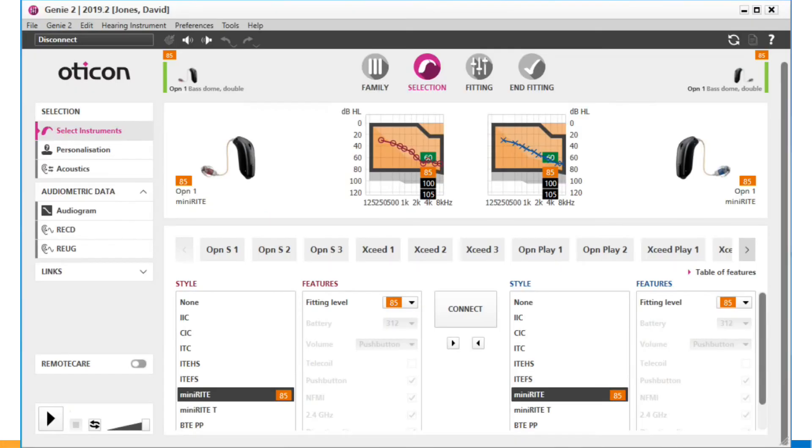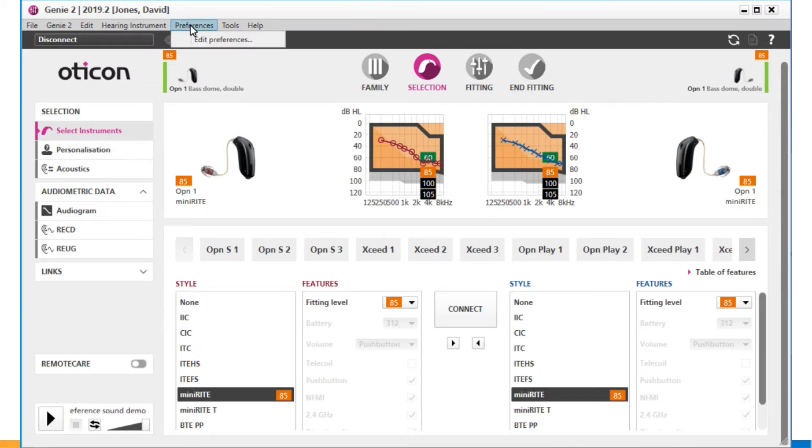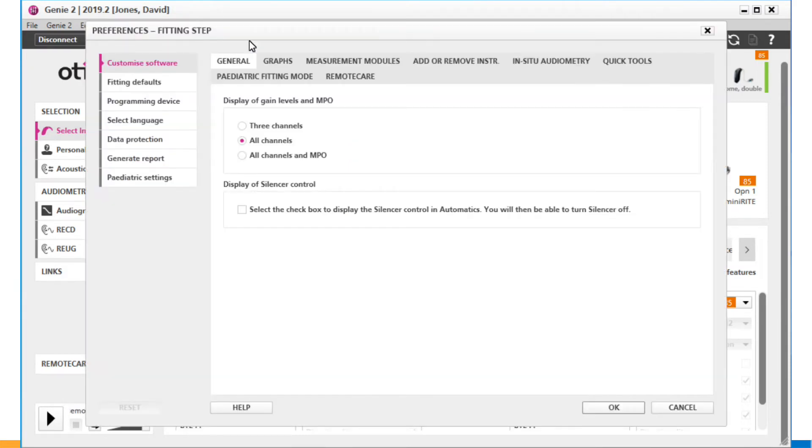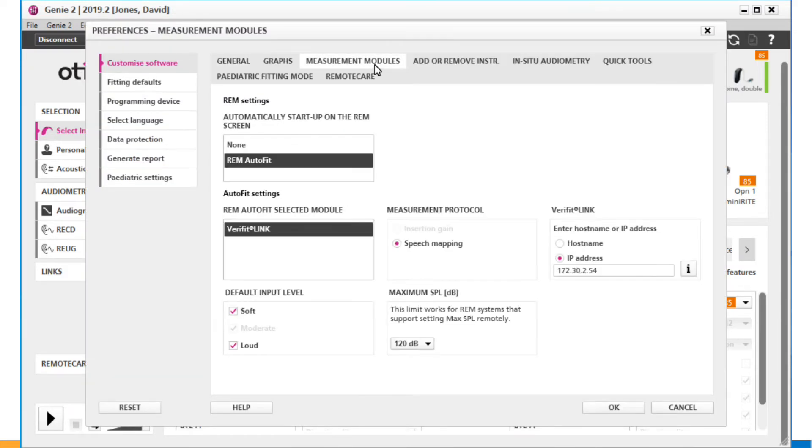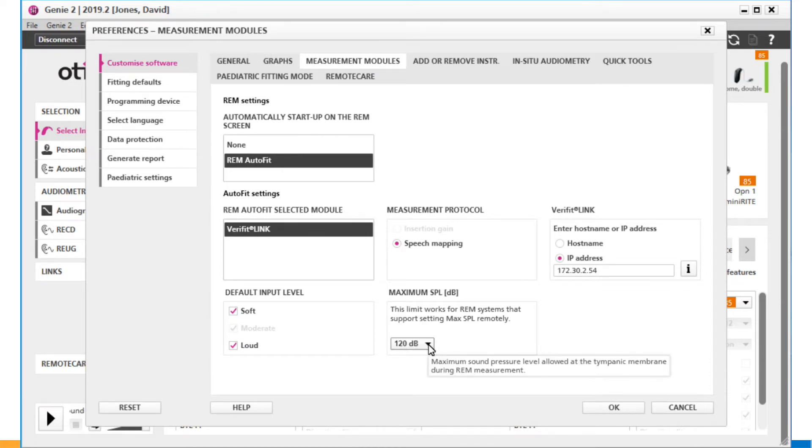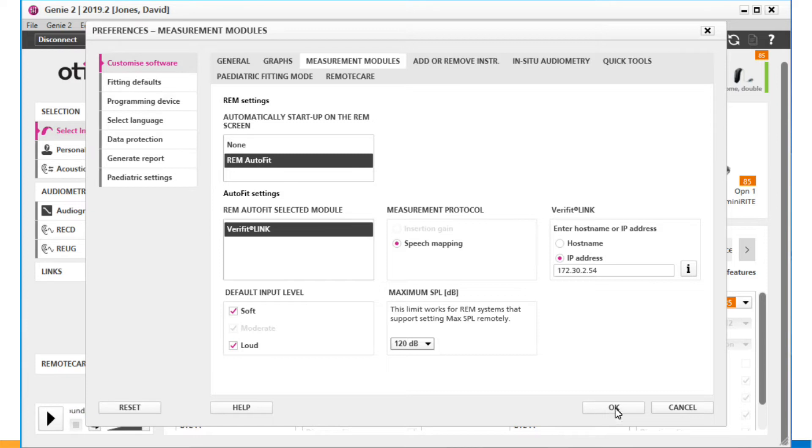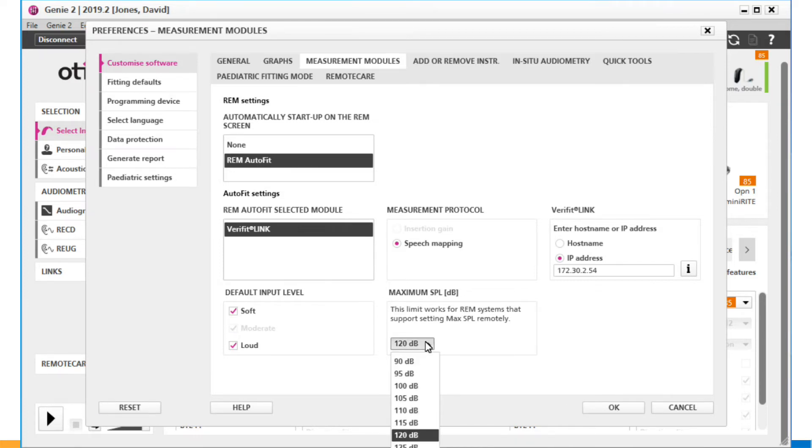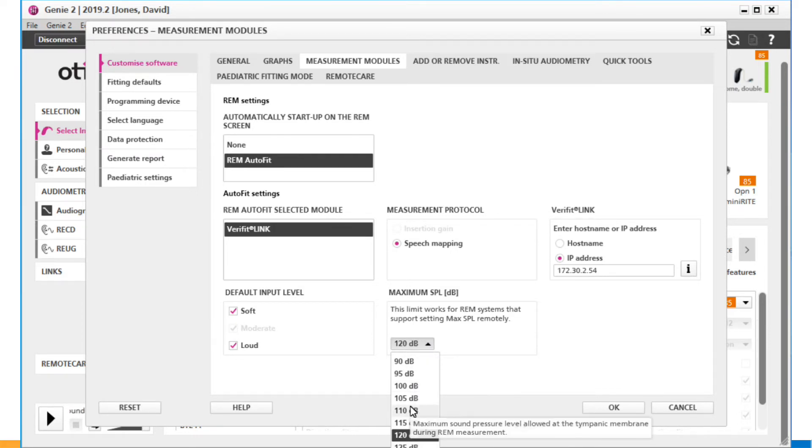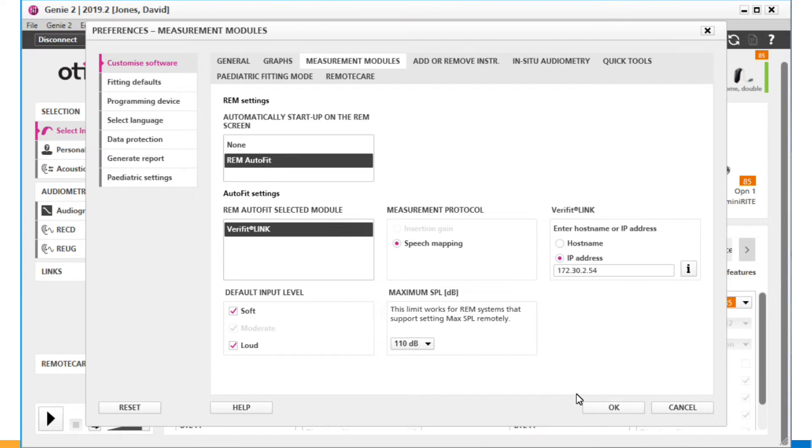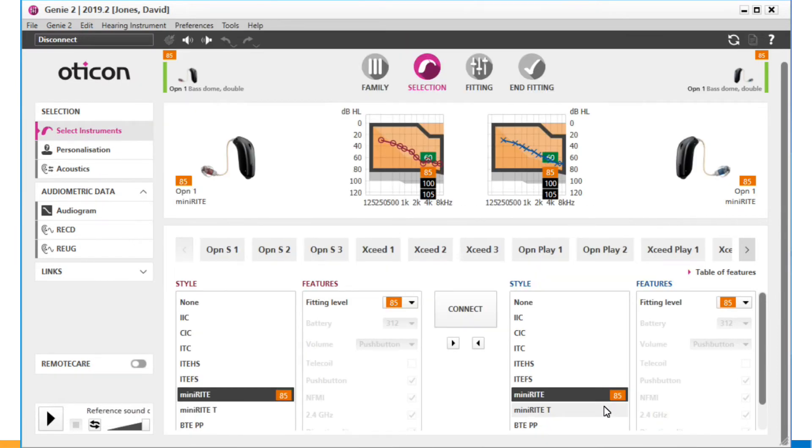Another new feature for users of VerifitLink is the ability to adjust Max TMSPL from the fitting software. The Max TMSPL setting is a safety limit in the software, which stops any real ear tests when a preset sound level has been reached in the ear canal. The default is 120, but this must often be raised for severe or profound losses, or lowered in cases where the client is sensitive to loud sounds. Since VerifitLink is designed so that the clinician runs the verification testing from the fitting PC, it's a matter of convenience that this setting can be altered from the fitting software as well. First release is again for Oticon's 2019.2 Genie 2.